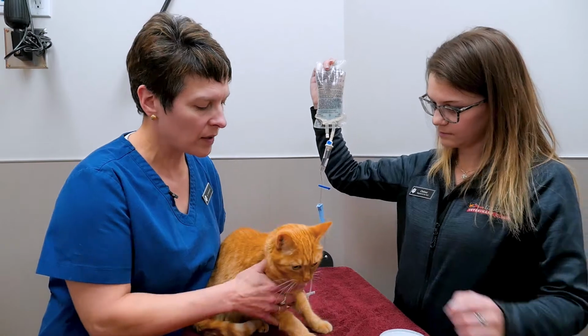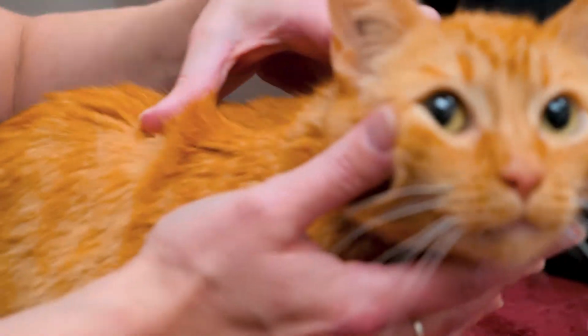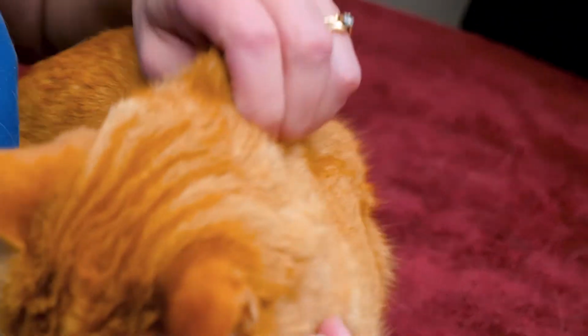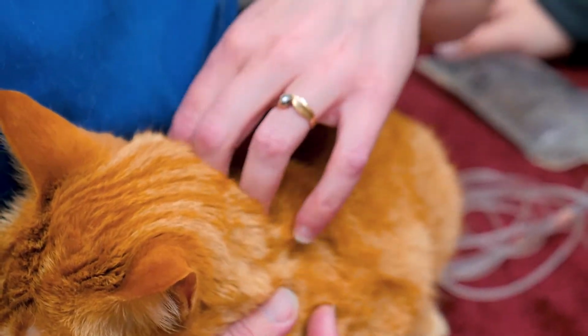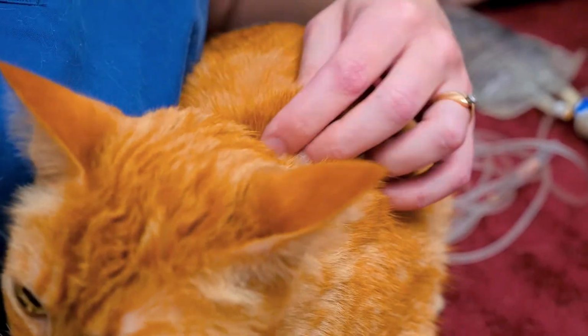So when you're giving the injection, we want to aim in this area, sort of between shoulder to shoulder, across the top of their back. The reason we want to do that is they're kind of used to being scruffed when they're kittens, and there's lots of extra tissue here for them to have space to give us that little bolus of fluids. It's also a place where they're most tolerant of actually having that injection done.